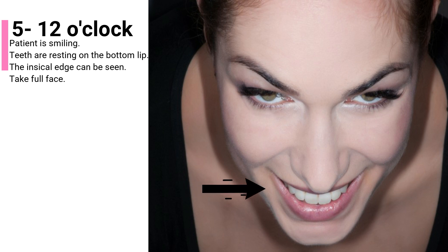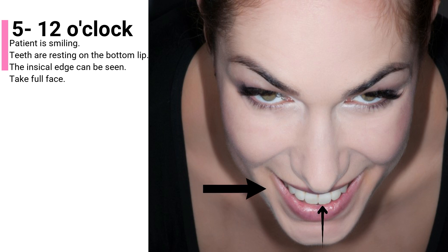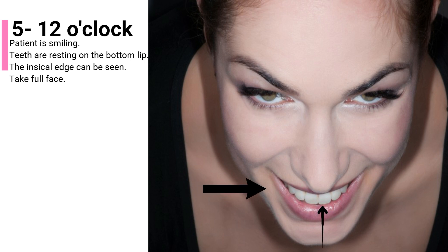Photo 5 is the 12 o'clock, which is one of the most important photos. Be sure the patient is smiling, and when smiling make sure the teeth are resting on the bottom lip. Be sure the incisal edge can be seen, and take the full face starting from the hairline.